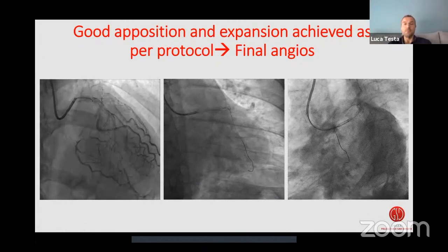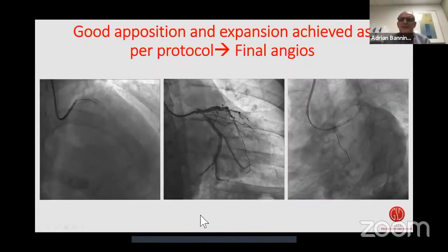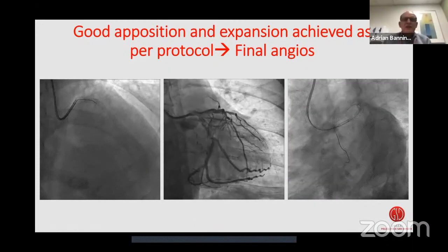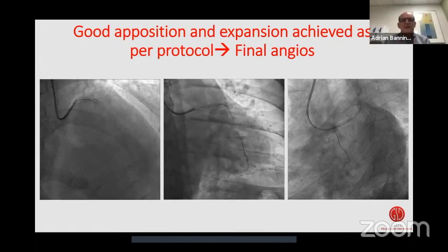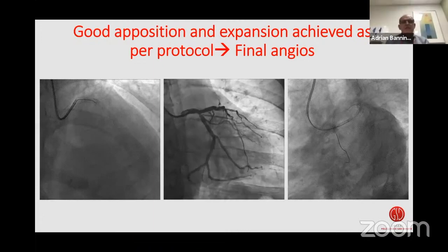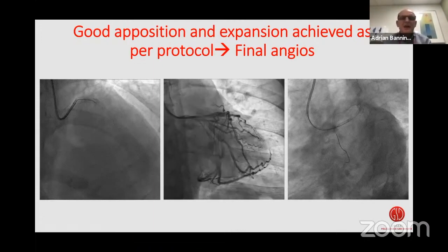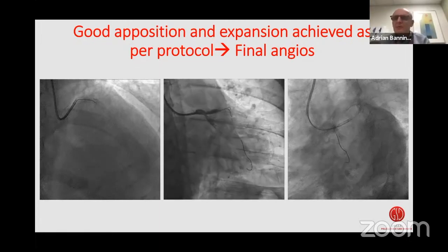I stopped. I think if you've gone at high pressure with a 4 balloon, I'm not sure what else you're going to do, really. There doesn't appear to be a lot of calcium. I don't think lithotripsy is going to help you further. So you're really going to be going for a 4-5 balloon, and then you perhaps run the risk of starting to compromise the circumflex. So I think you've got a very nice result with one stent, and I think there is a benefit from that in this case. Perfect is the enemy of good, and I agree.